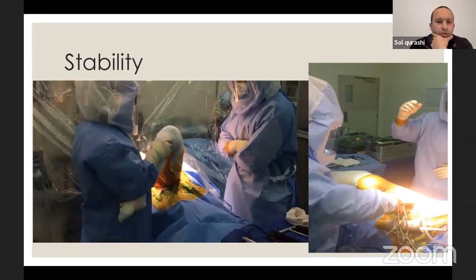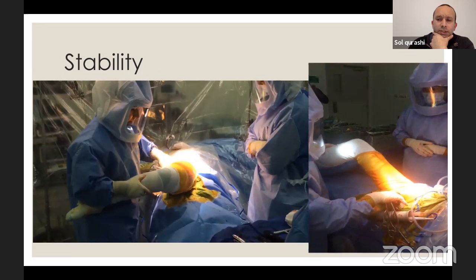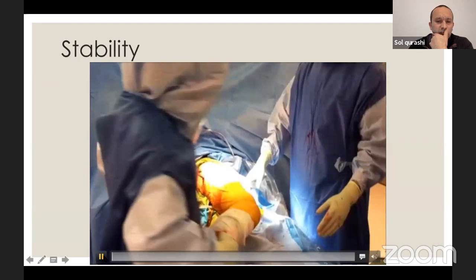I think we already saw this video. I'm going to stop that one. This one. So here we're testing extension and external rotation. This is again a stability check.